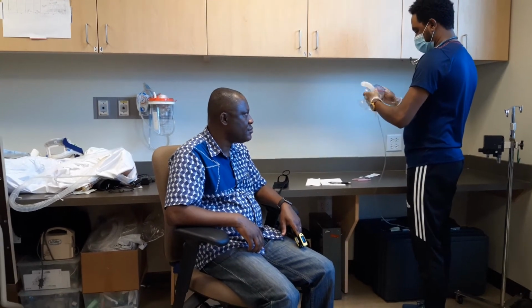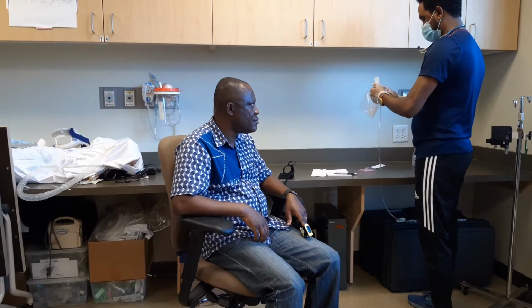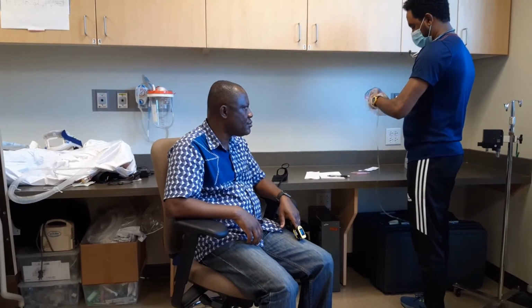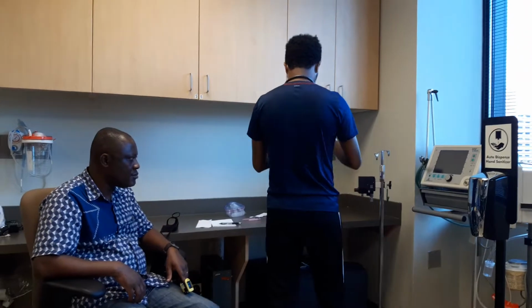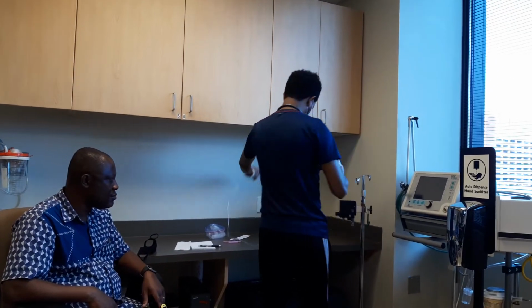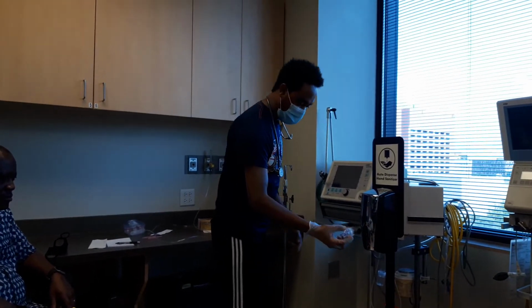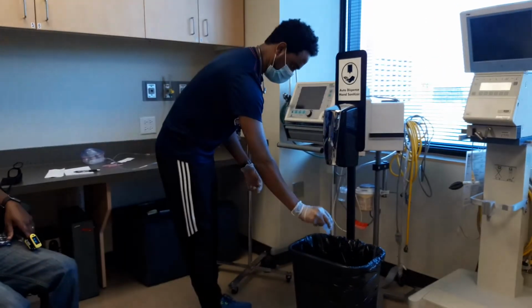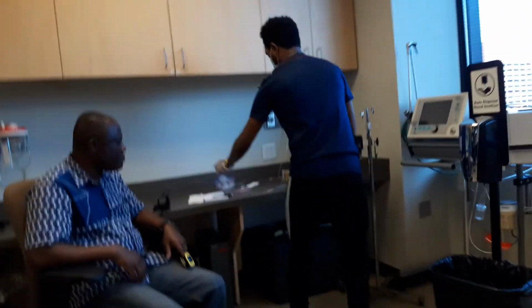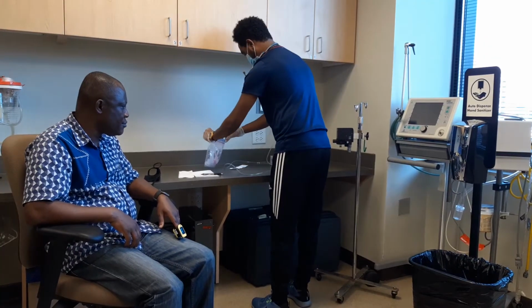The mouthpiece, cap in here, and the T cap. I'm going to dump this residual medication in the sink. Okay, put this supply in here.